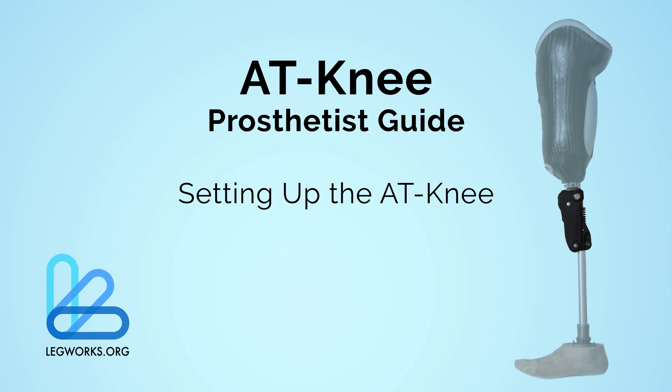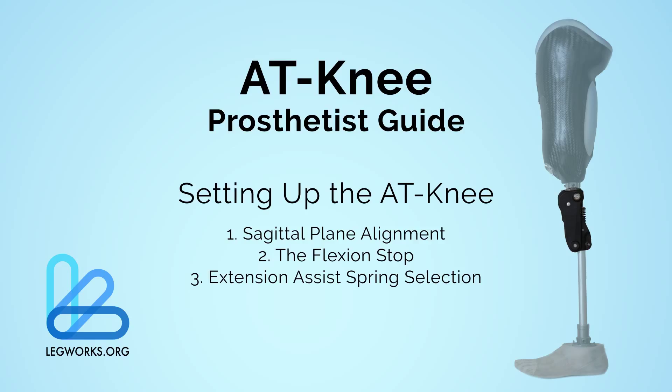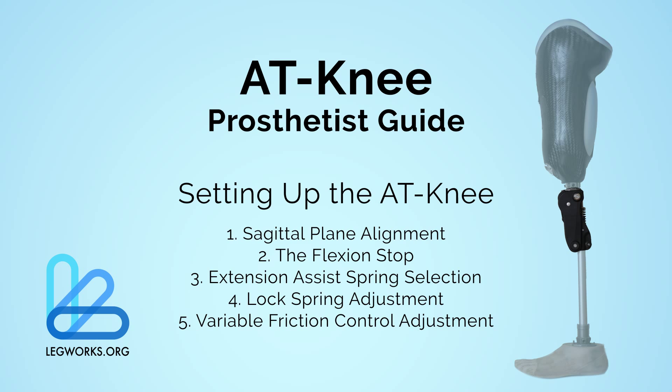Setting up the AT-Knee for use is simple and straightforward. There are five considerations to account for when fitting a patient with the AT-Knee: sagittal plane alignment, the flexion stop, extension assist spring selection, the lock spring adjustment, and the variable friction control adjustment.